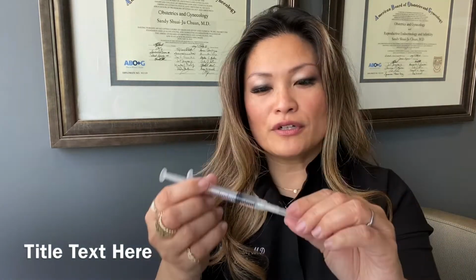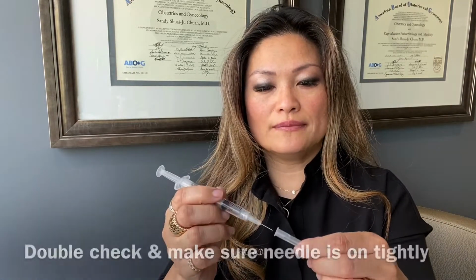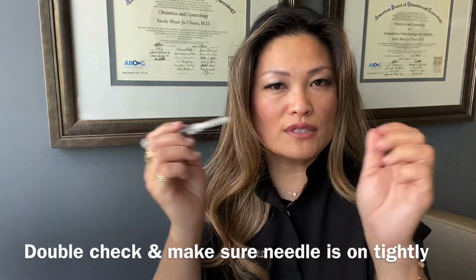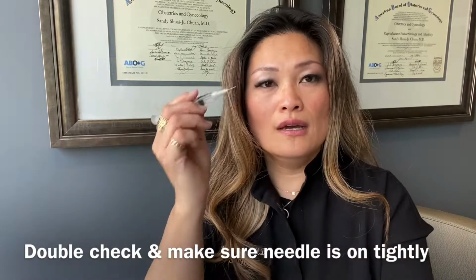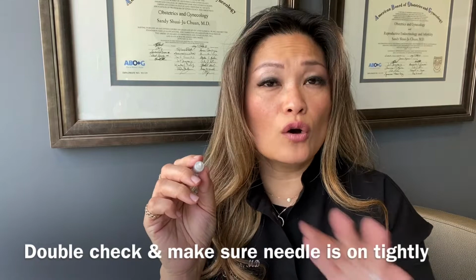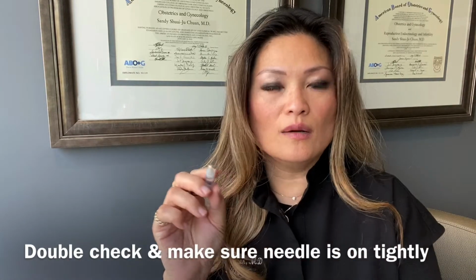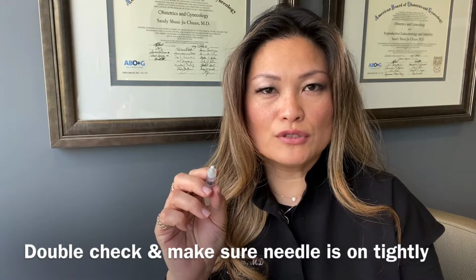Okay, so now this is your Menopur, and you want to uncap it, right? Before I uncap it, I always double check and make sure my needle's on well. This is on really tightly, so it's good. The Gonal-F needle is attached, so you don't have to worry about it. But whenever you have to switch needles, I'm always really careful when I do the injection.